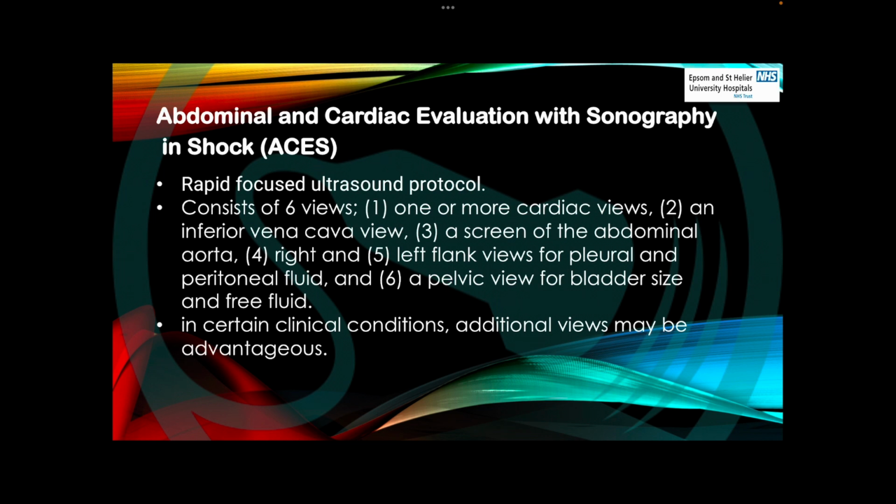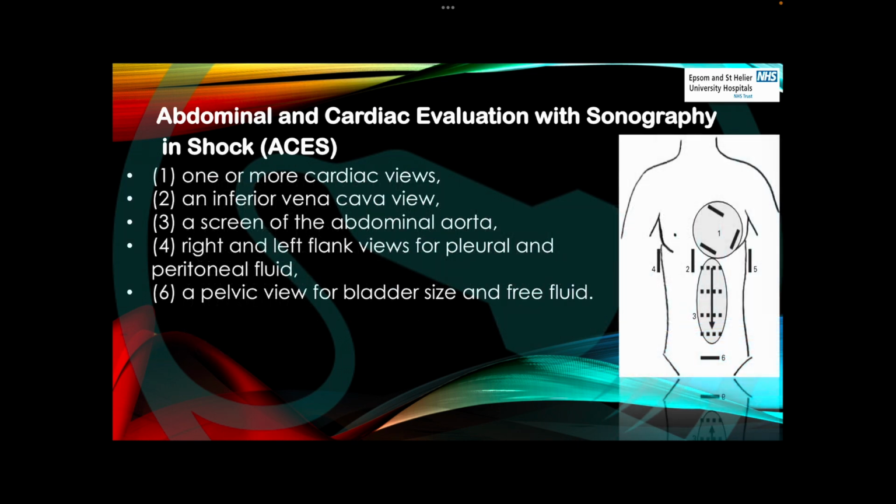In certain clinical conditions, additional views may be advantageous, as we said, like if we check for the popliteal vein or for the femoral vein. These are advantages to find out if there are any additional views. Here are the areas, how to do the views and where we are going to put the probes.